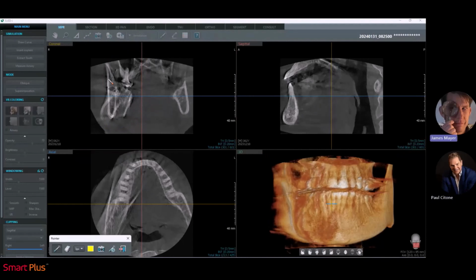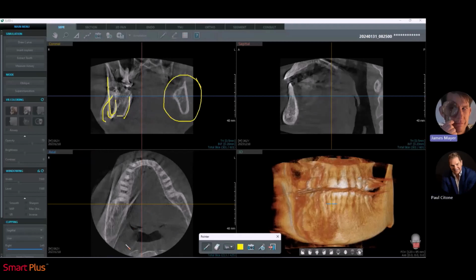Yeah, I agree. So I'm following the ramus down here, and as you described, here's another ghosting. You can see a lot of ghosting through here, whereas on the patient's left side, look how clear it is, which is also translated in the mandible, patient's right side versus the left side right here. So that's a very good example of looking and recognizing patient movement within a scan.